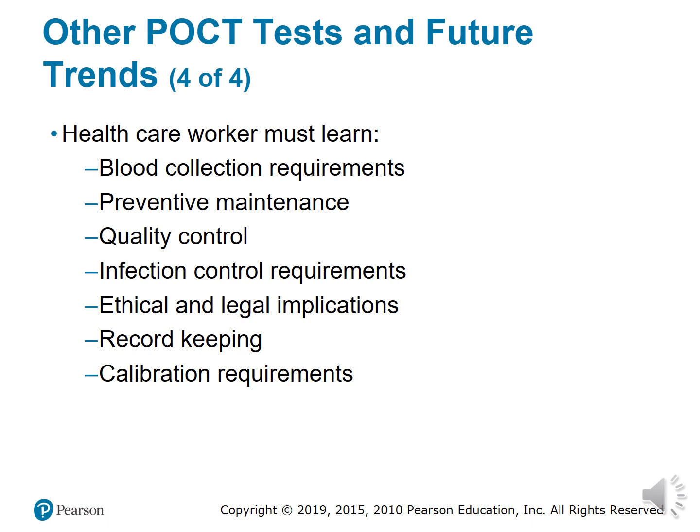Calibration requirements. Always remember, make sure you read your manual on how to properly use this instrument, because it will tell you after so many patients, make sure you run a calibration test. And that is very important in order for the machine to always run effectively and to give you adequate results each time you use it.